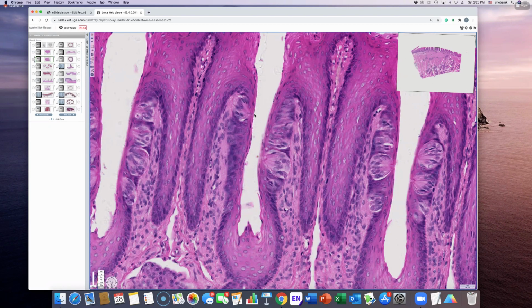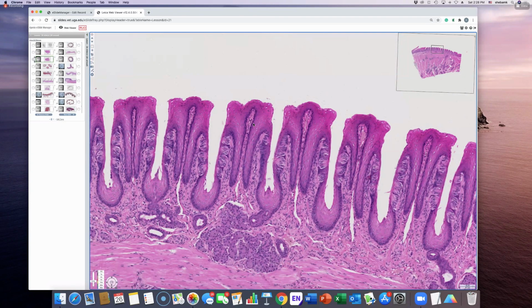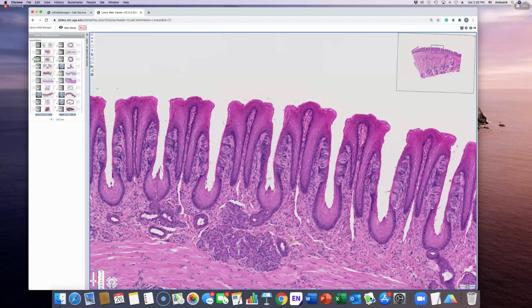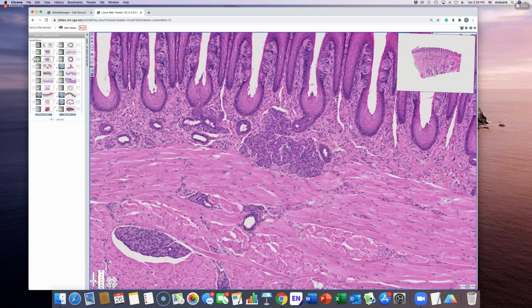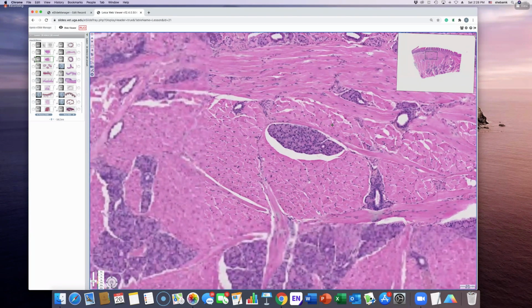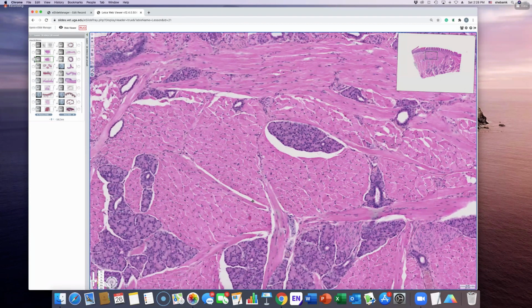And the opening here is called the pore. Okay? So that's the taste pore for you right there. So these are all gustatory papillae. What is this structure here? Salivary glands. Yes, okay, so that's kind of emptying. So these are all ducts of the salivary gland, okay? More salivary gland here.